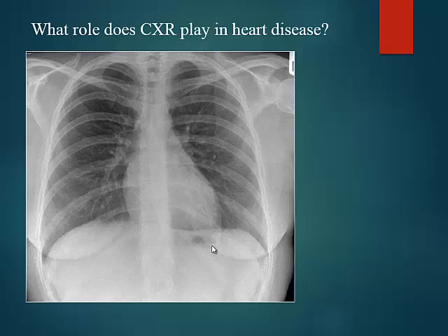Heart size and evidence of pulmonary. Okay, so in a patient you want to assess what? If the patient has heart failure or not, by looking at pleural effusions on the chest X-ray, by looking at pulmonary edema. So we're trying to say, does the patient have heart failure or not? Okay, so that important use of chest X-ray, I would think, is the most important and perhaps the most widely used indication for a chest X-ray in clinical practice in a hospital.